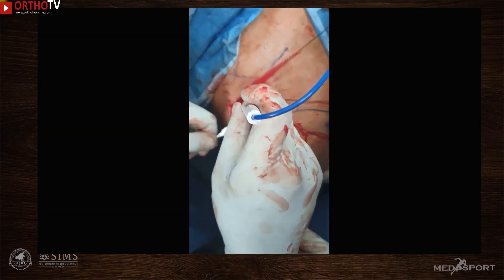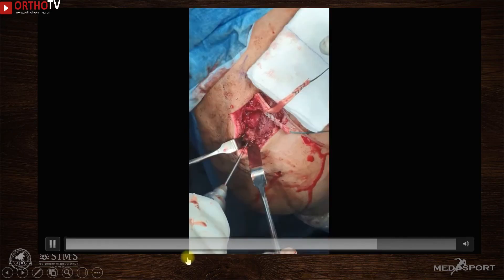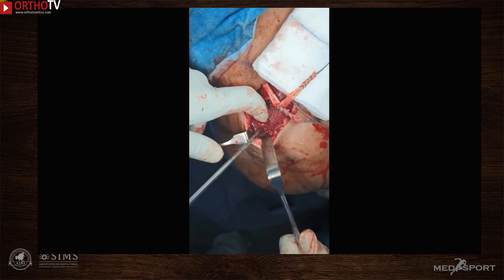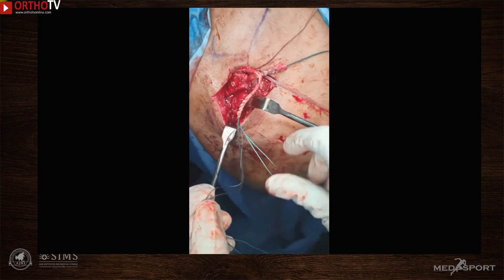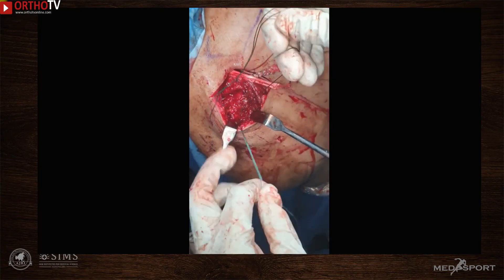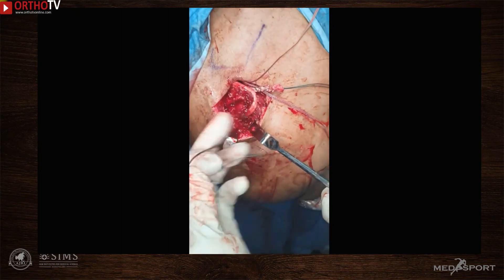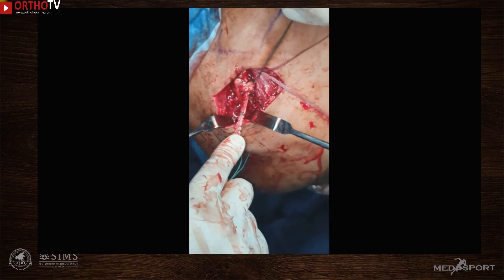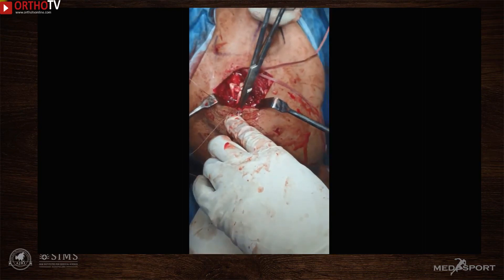The superior aspect of the acromion is exposed approximately 1 cm from its medial length. A K-wire is used to start a tunnel, which is over-drilled with a 4.5 mm cannulated drill bit. An internal wire loop is passed and exchanged for an Ethibond loop. The longer limb of the semitendinosus tendon is then pulled from inferior to superior through this tunnel. The two limbs of the tendon are brought together, crossed, tensioned, and fixed with multiple number-zero FiberWire sutures.